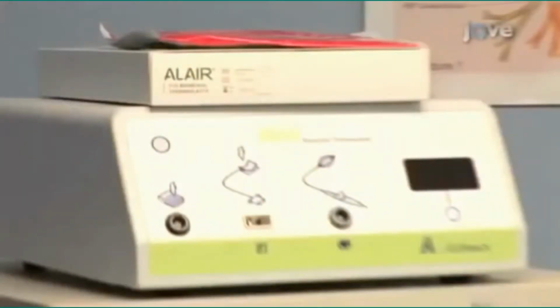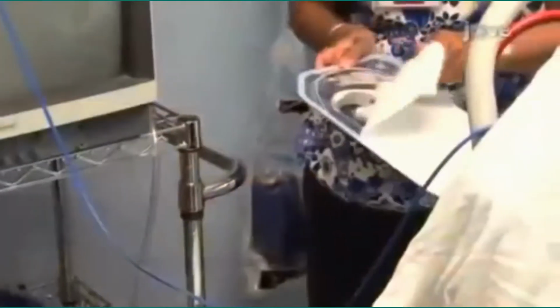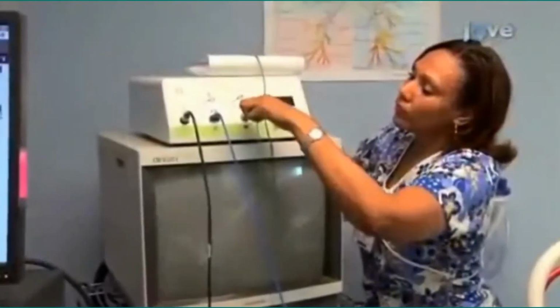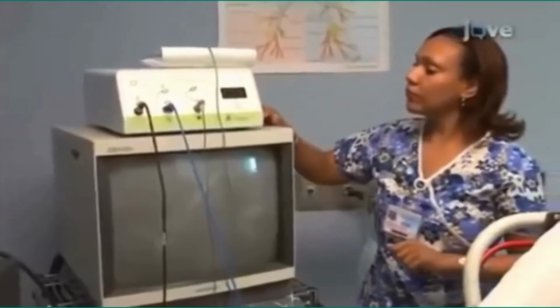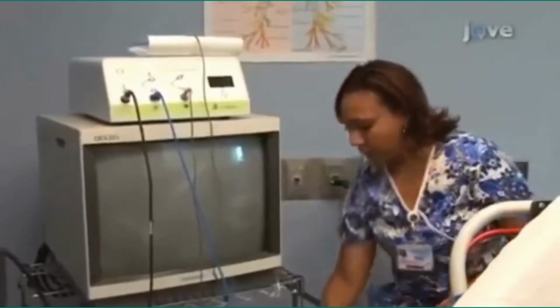Bronchial thermoplasty is performed using the Alair system. Connect the foot switch to the Alair RF controller. The single-use disposable Alair catheter is removed from the package and connected to the Alair RF controller. The controller is turned on, a self-test is automatically performed, and a green light signals that the controller is functional.